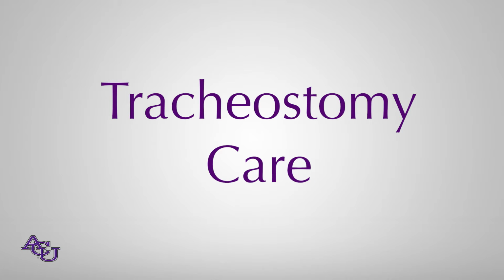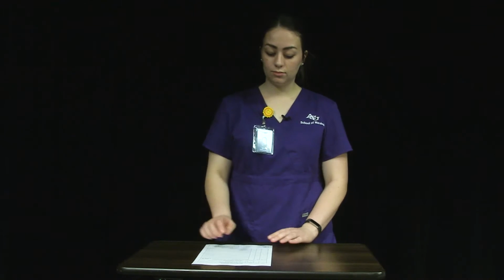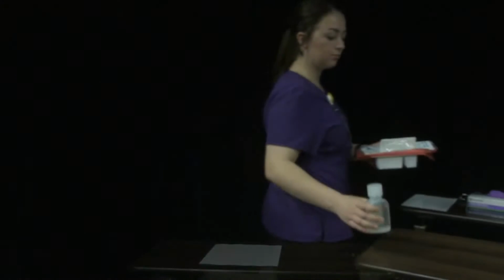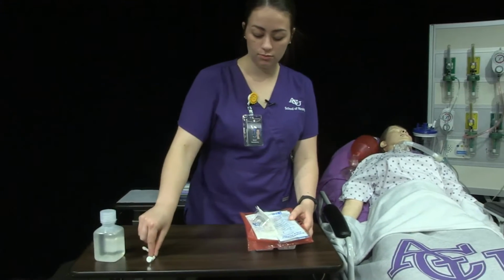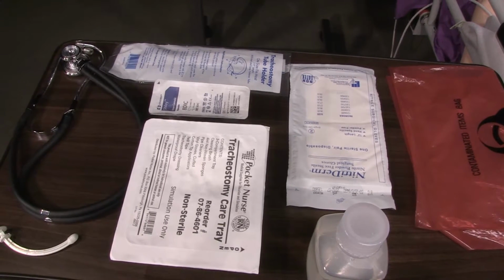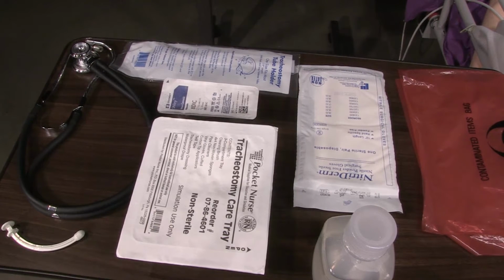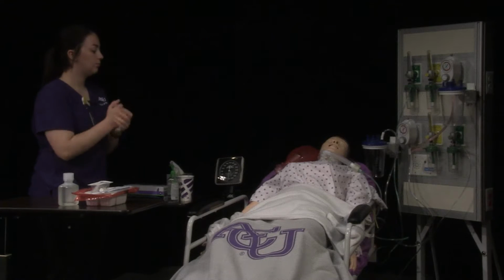Tracheostomy Care. Check PCP orders. Gather supplies and equipment. Perform hand hygiene and maintain standard precautions.